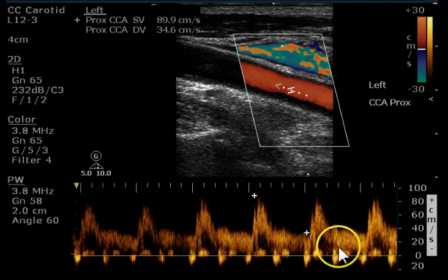This back and forth motion you see here is probably due to a bounding artery. This Doppler gate is in the middle of the vessel, but it's not in the middle of the flow lumen. If it was moved up a millimeter or two, we wouldn't have the plaque bouncing through the Doppler gate, which is what's giving this signal down here.